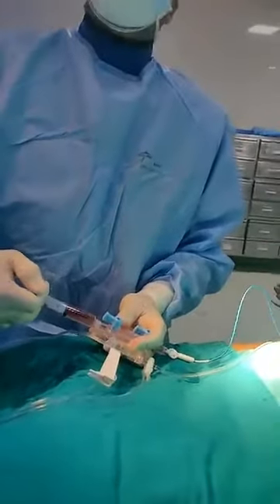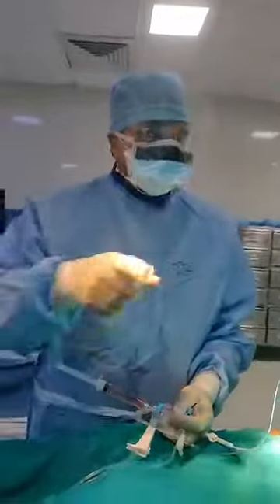We are showing here how we are injecting the dye and then watching the results. This is how the machine moves — the machine moves like this to give the proper view of various arteries.